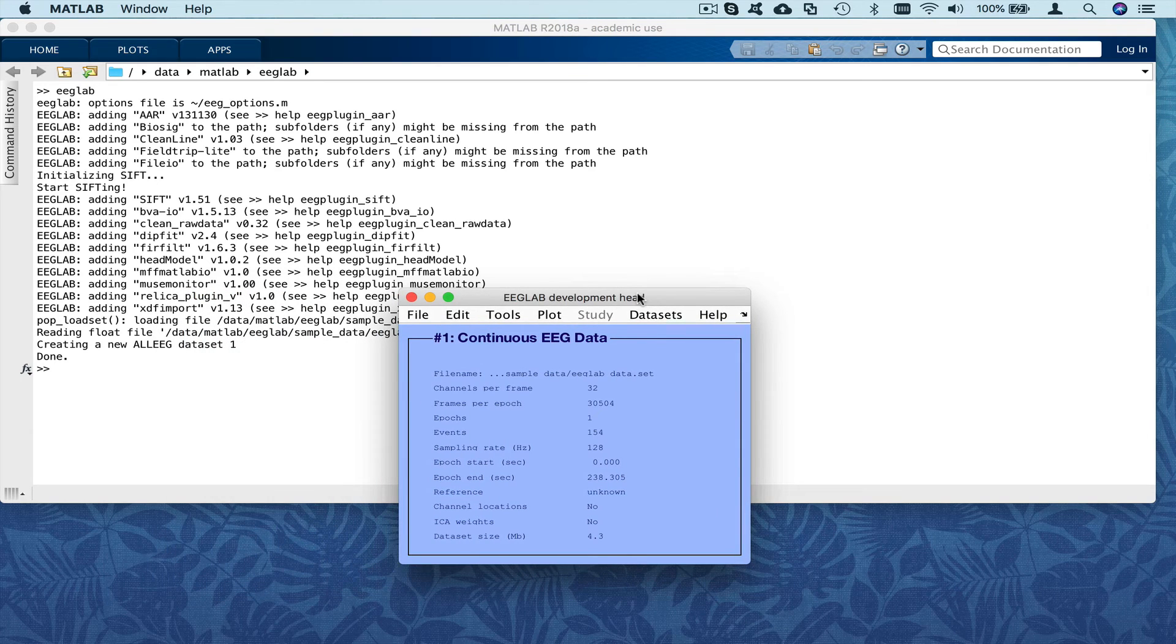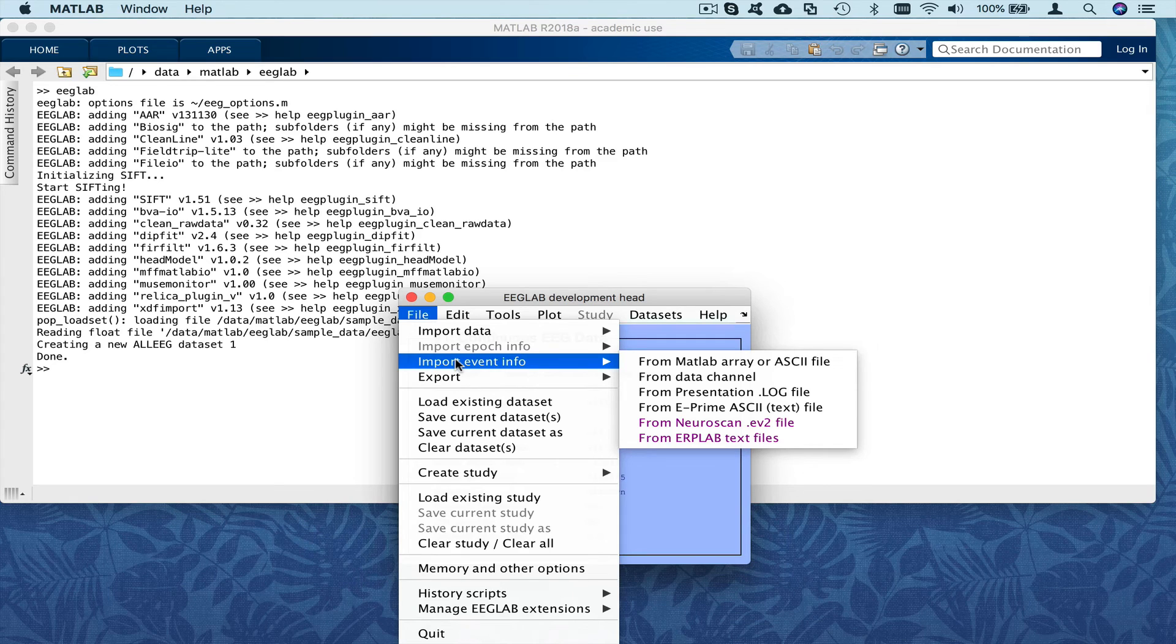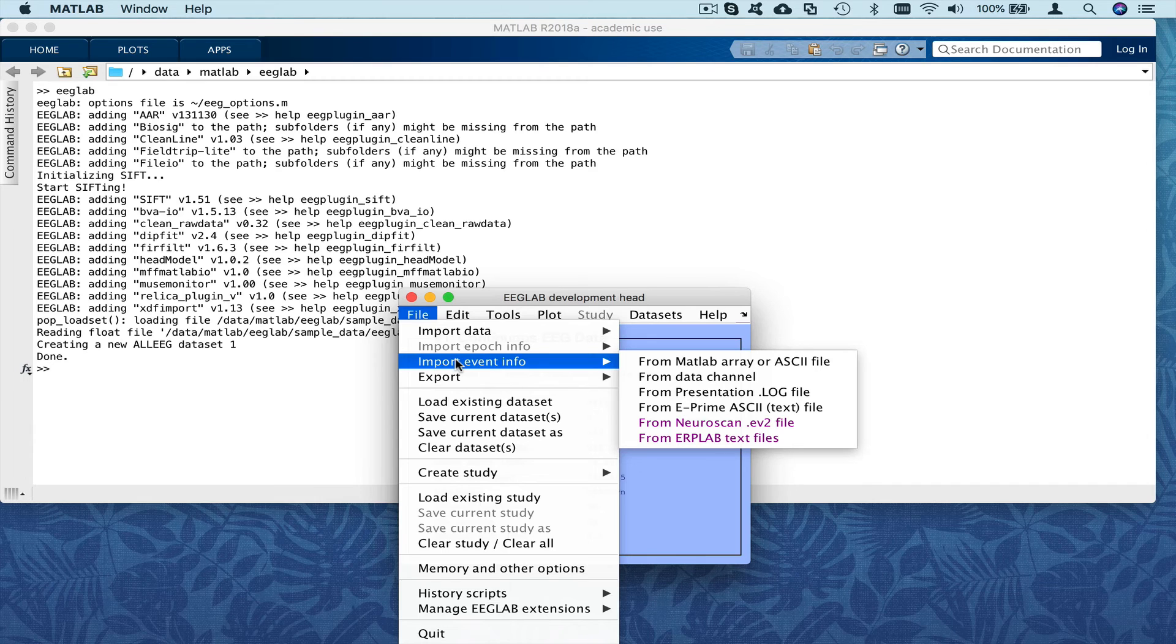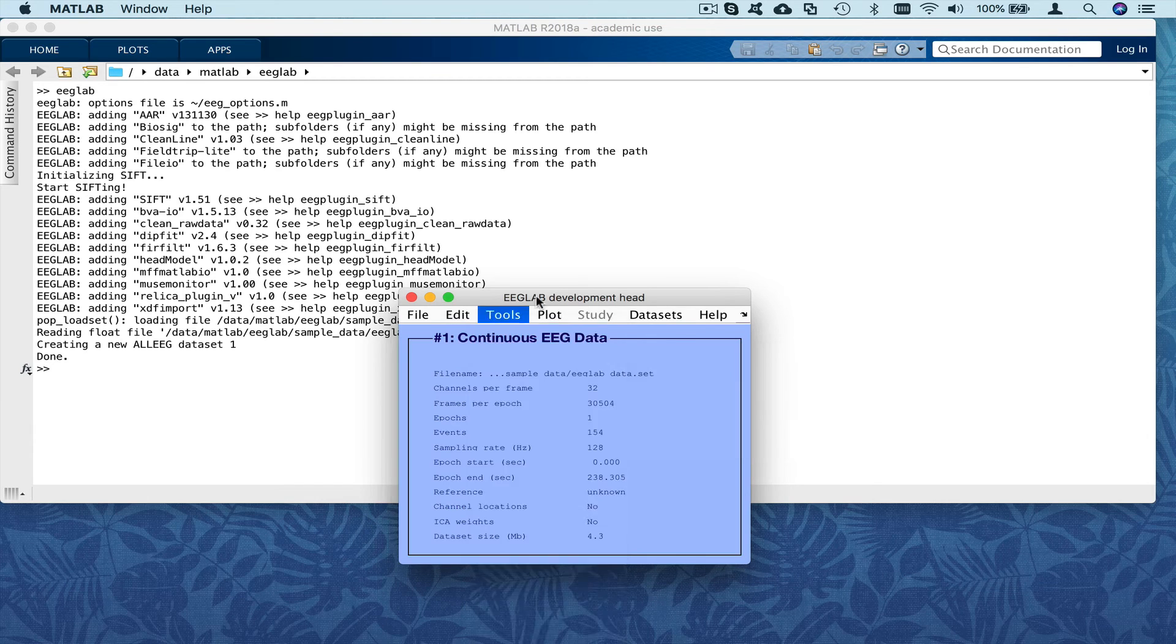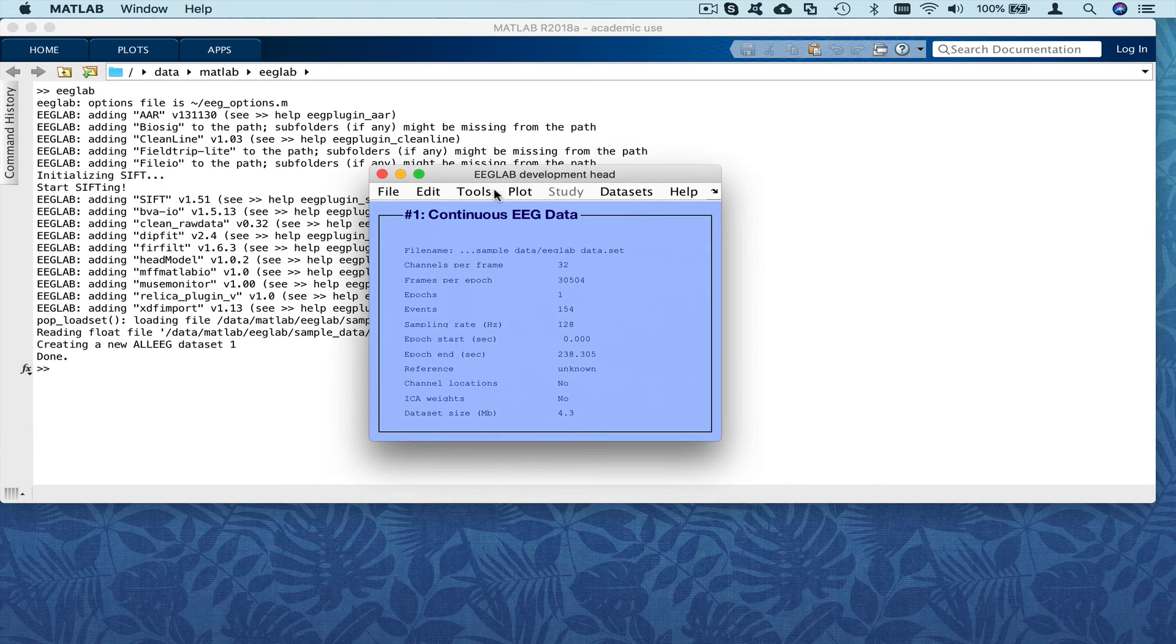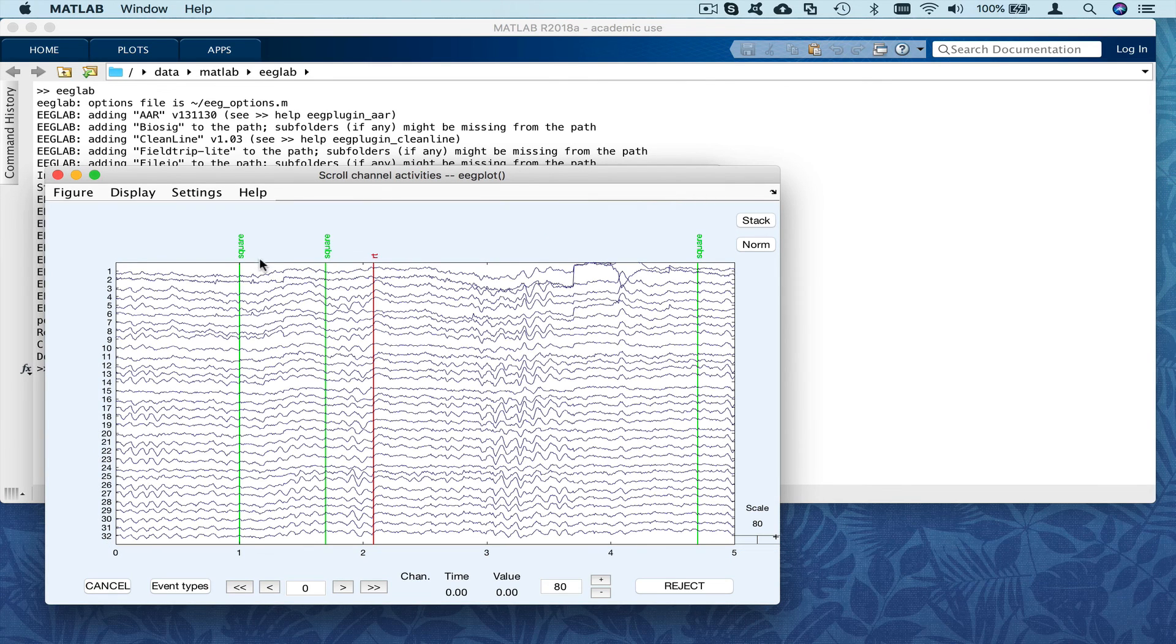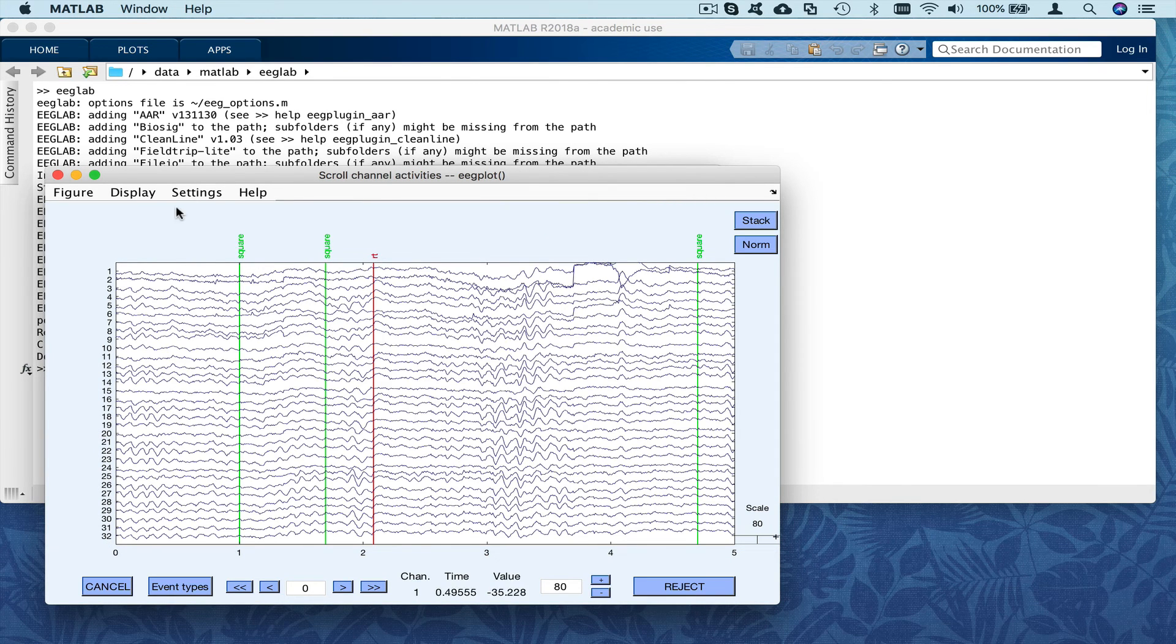This data set doesn't need events to be imported, that's the event menu, because it already has events. And we can see the event, and when we plot them, we can see them here, for example, square, square reaction time.